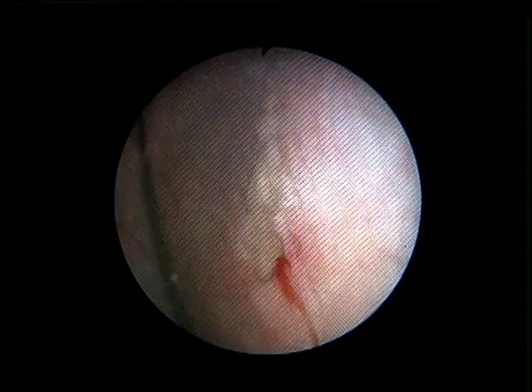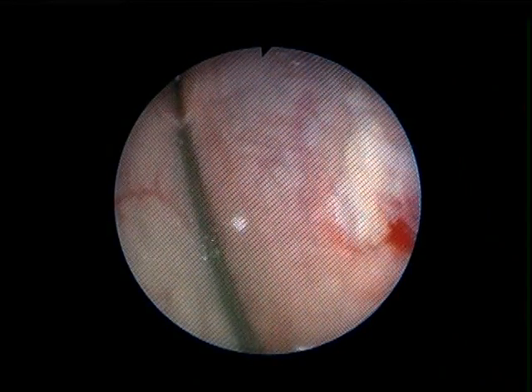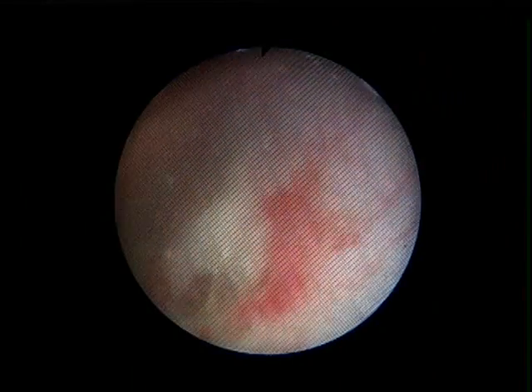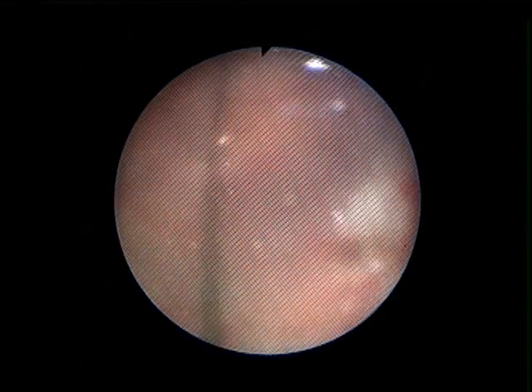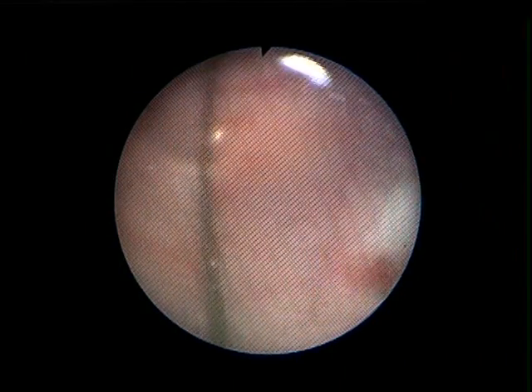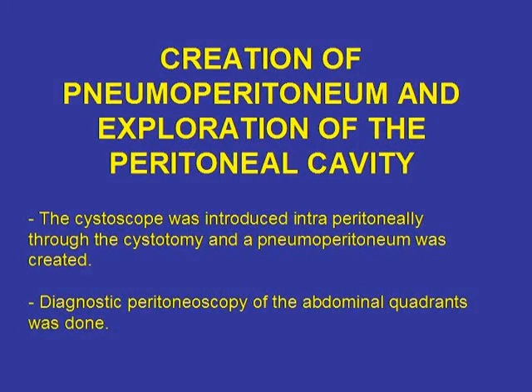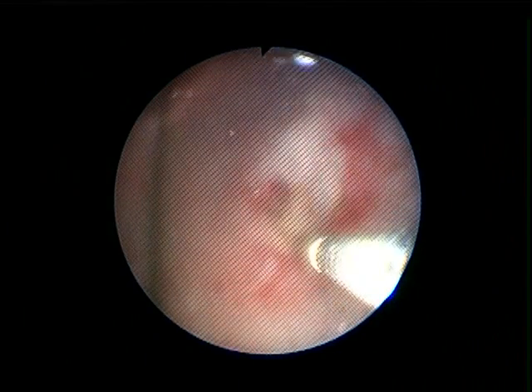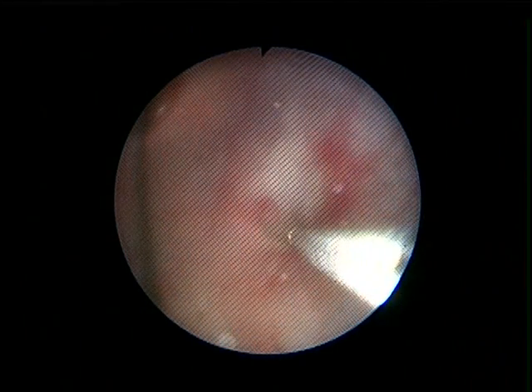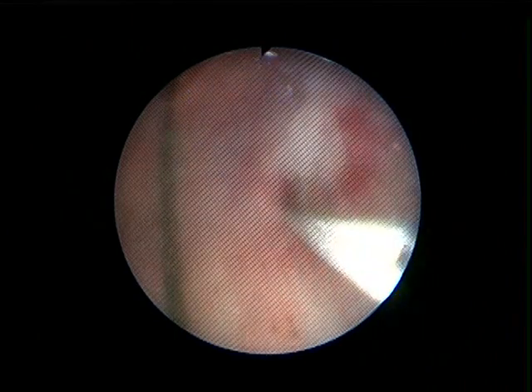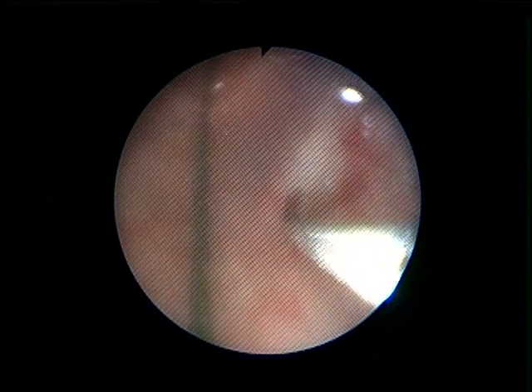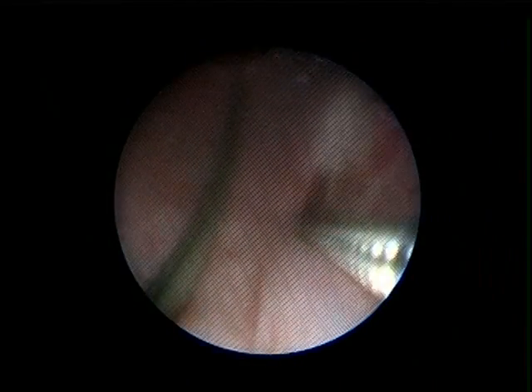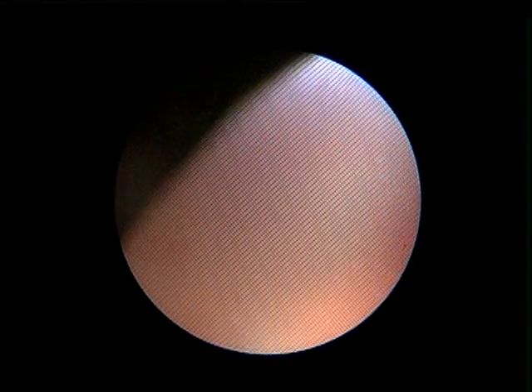The biopsy forceps was used to open the bladder wall and layers under vision. Any bleeding from the surrounding area was diathermized so as to keep the vision clear. The gland forceps was passed through the bladder opening first to confirm that the peritoneum was entered, and the scope was pushed through the bladder opening in a manner that the opening snugly fitted the scope. This prevented any spillage of the bladder contents into the peritoneum.